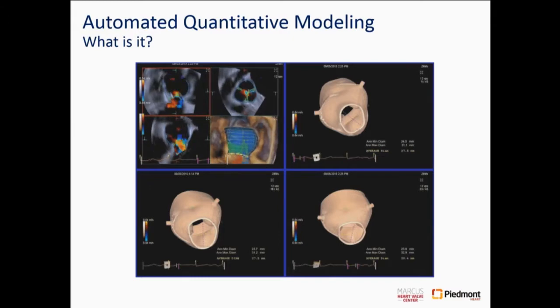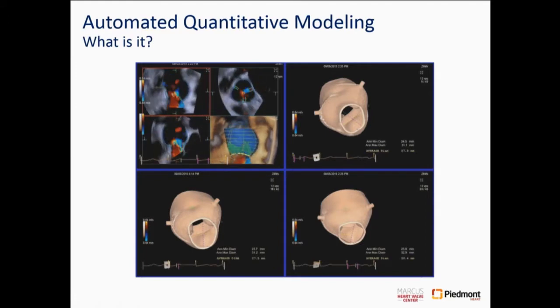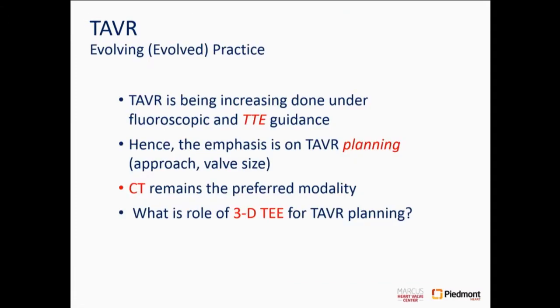So one of the problems of medical imaging, and that happens in the CT world too, is that it's done in the dark room, so you don't see it. In the echo, you actually get to see that manipulation of the line, so you tend to disbelieve the data more often than you disbelieve the CT data. However, it is important, I believe, to have some reproducibility that is reassuring within your own center or your hands, so that you can say this number is a reliable number. So that's the other advantage of using automation.